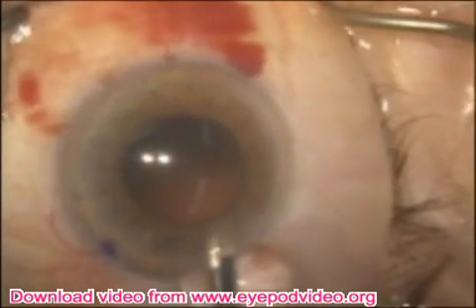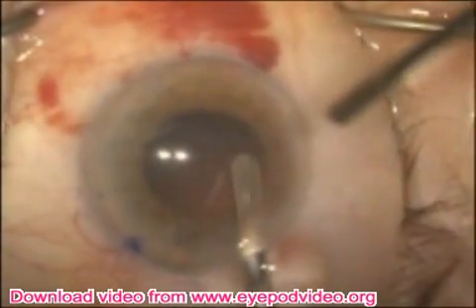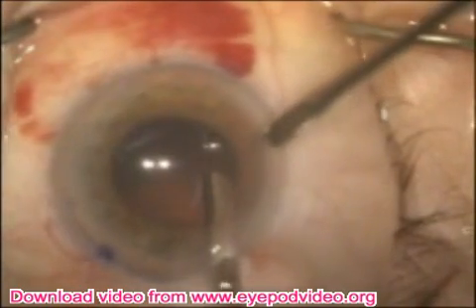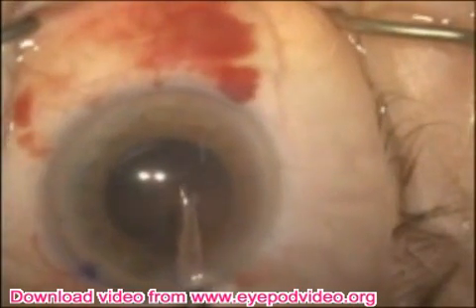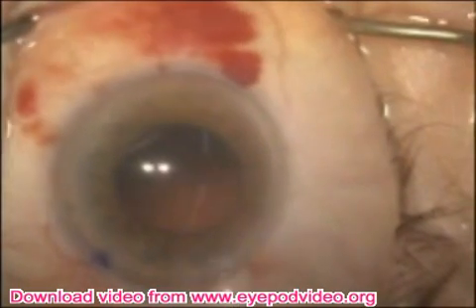The cylinder is then placed into the eye through the normal wound and the reverse is done with the plunger pushing down. The capsular tension ring is pushed into the capsular bag, pushing the cylinder to the side as much as possible and allowing the natural curvature of the capsular tension ring.